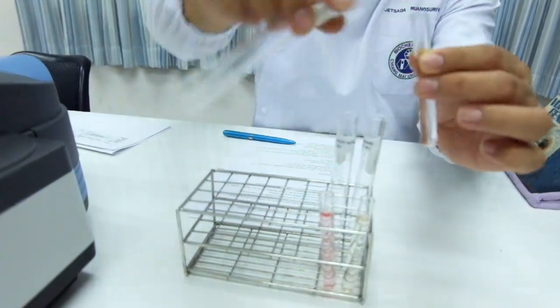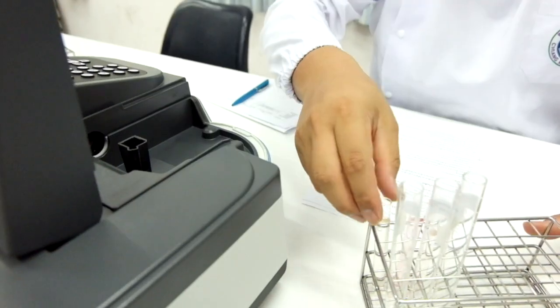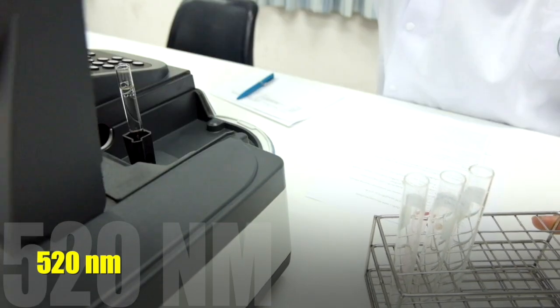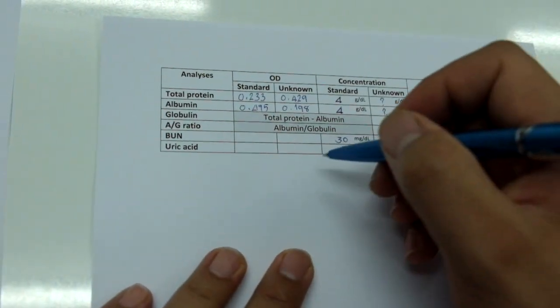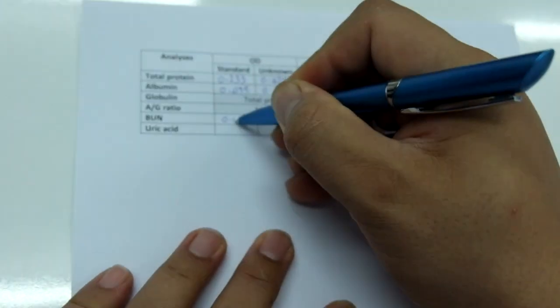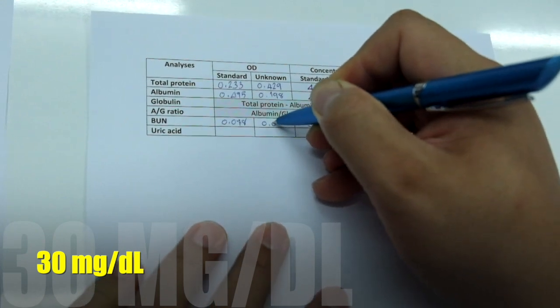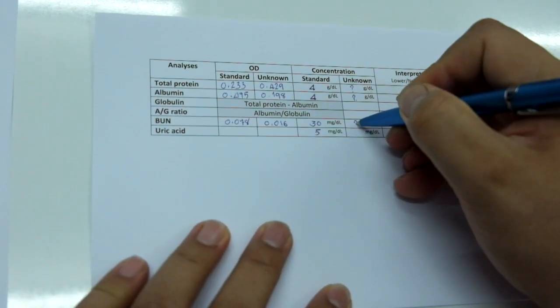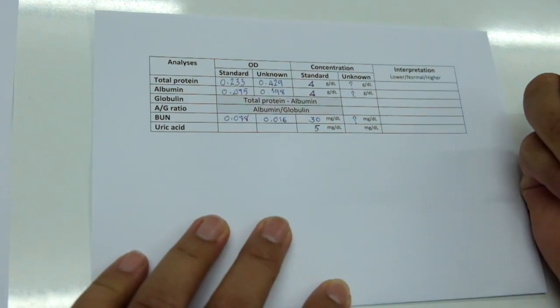Determine the absorbance in the unknown plasma and the standard at the wavelength of 520 nanometer and set 0 with the water tube. Record the absorbance and calculate for BUN concentration from the standard absorbance value with 30 mg per deciliter in the concentration and take a note of the result finally.